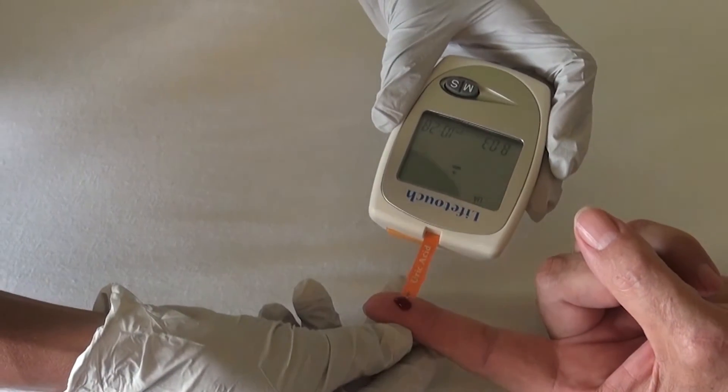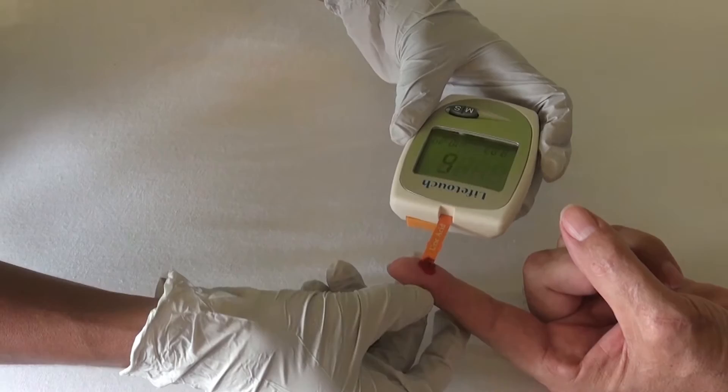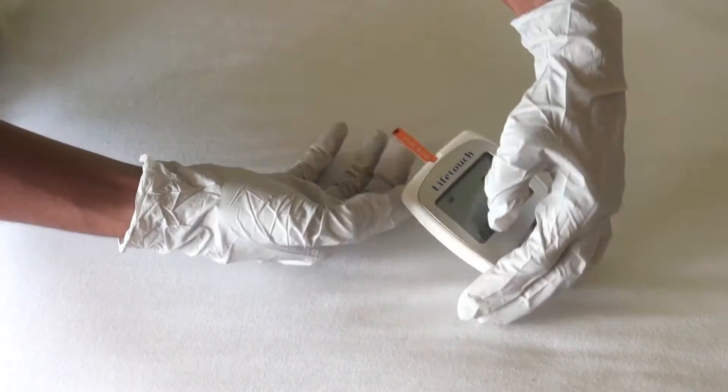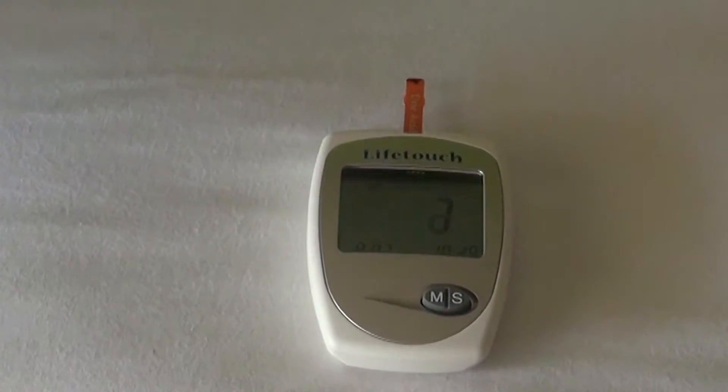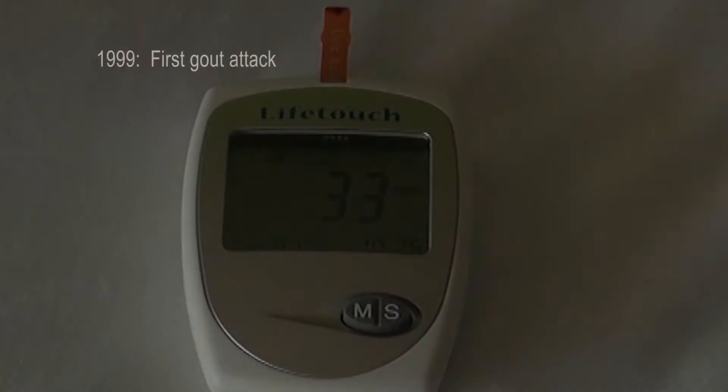Take the unit and let the strip absorb some blood. Wait a bit and take your reading — that's it, done. The result, 3.3 mg per deciliter, is the reading of my uric acid level today.